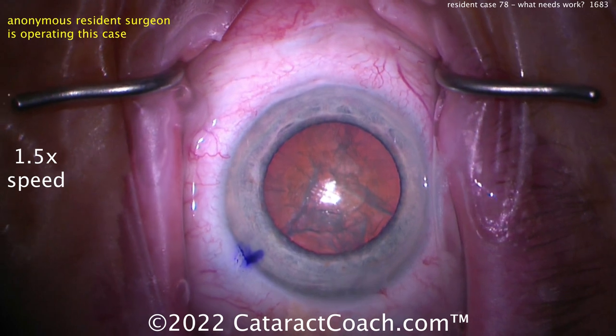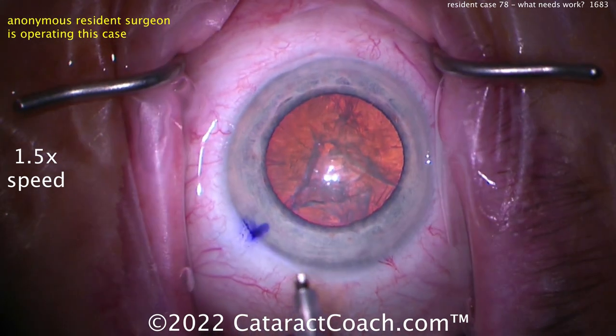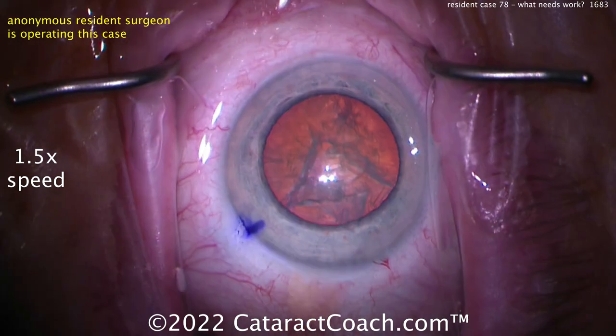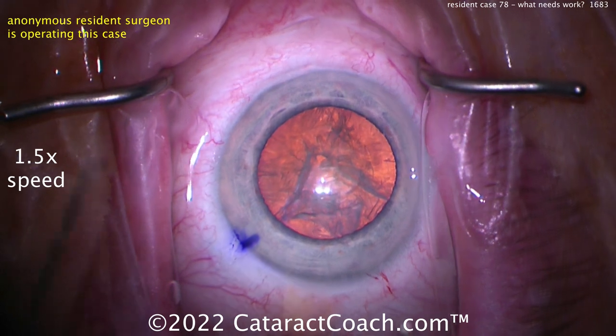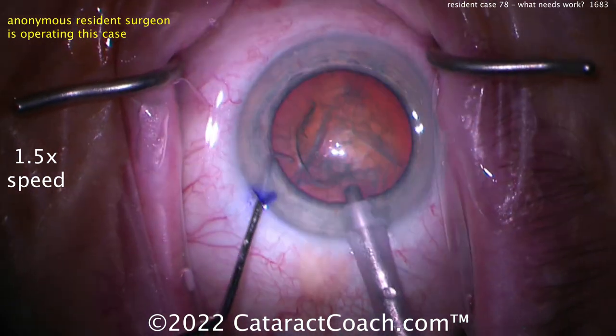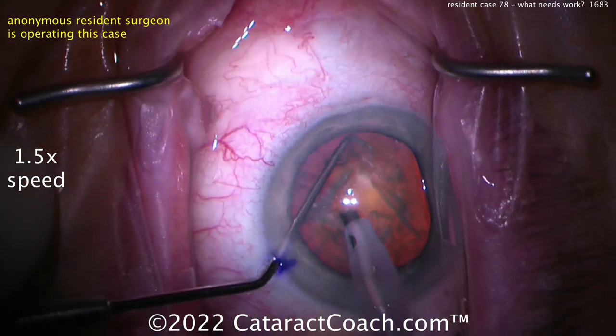So at one-and-a-half speed it's five minutes 46 seconds, meaning full speed is probably about eight and a half to nine minutes — that's fantastic. Now, not about speed: case 78, honestly one of my best pearls for you is to slow down. Try to perfect every step, take your time.